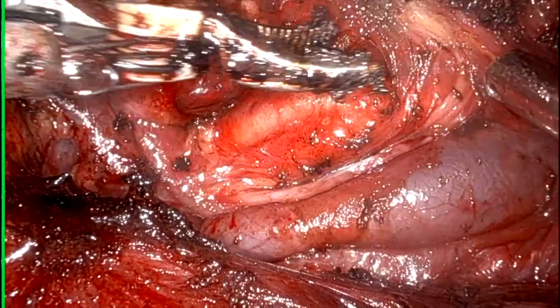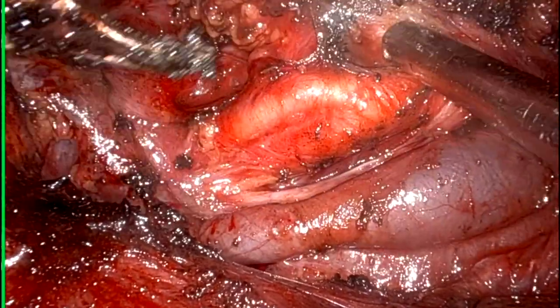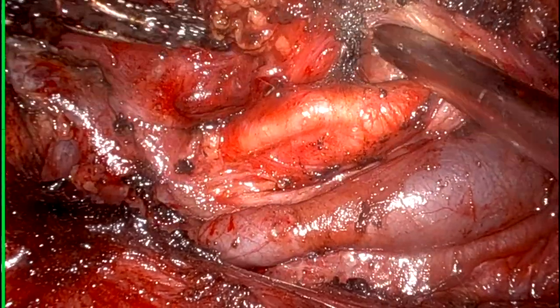Dissecting lower down, working along carotid artery.